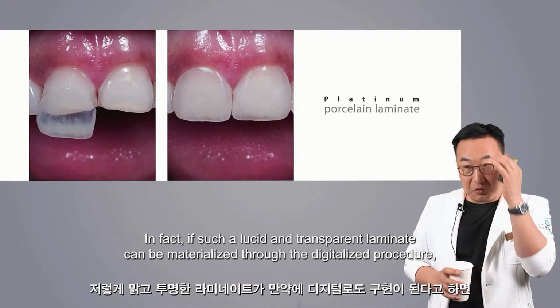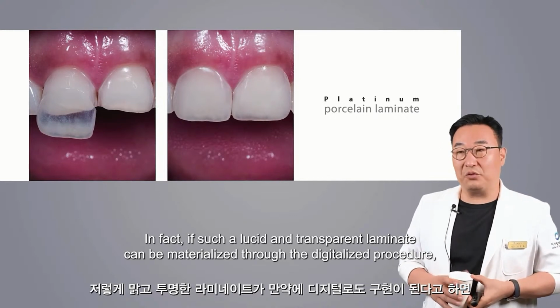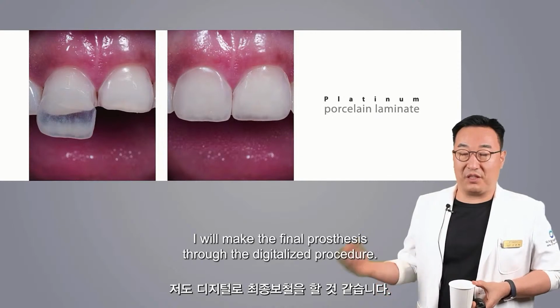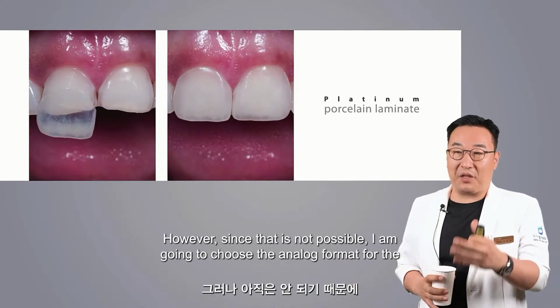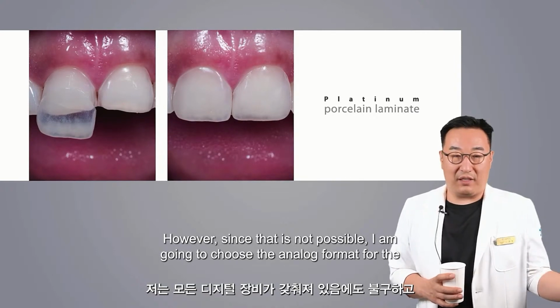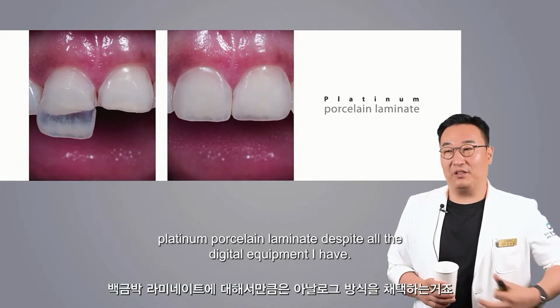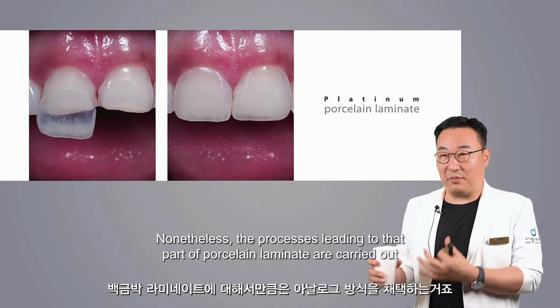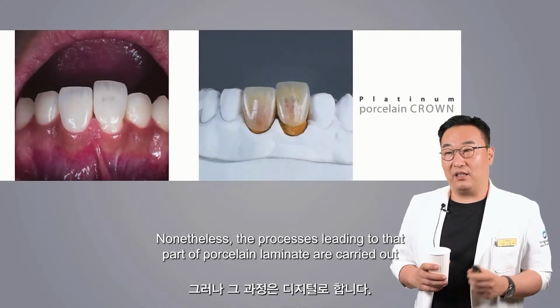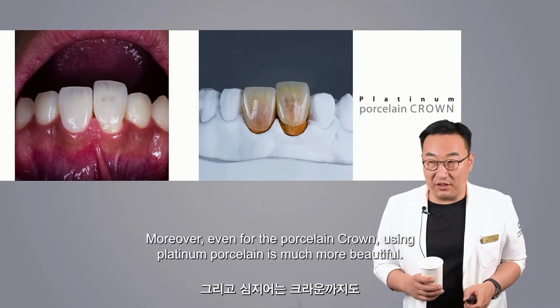In fact, if such a lucid and transparent laminate can be materialized through the digitalized procedure, I will make the final prosthesis through the digitalized procedure. However, since that is not possible, I am going to choose the analog format for the platinum porcelain laminate, despite all the digital equipment I have. Nonetheless, the processes leading to that part of porcelain laminate are carried out through the digitalized format.